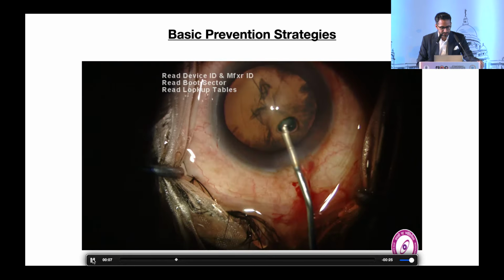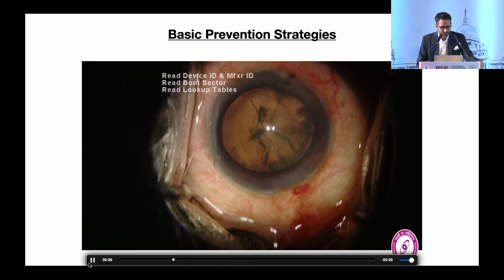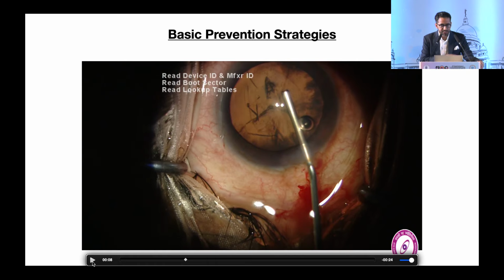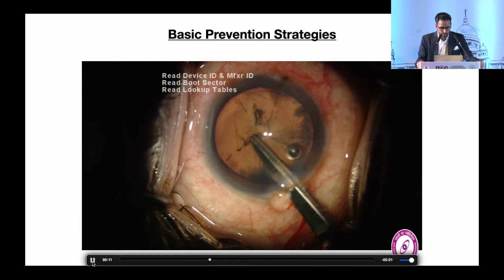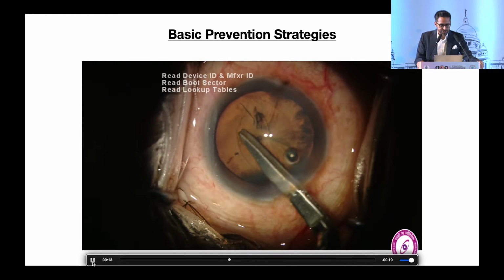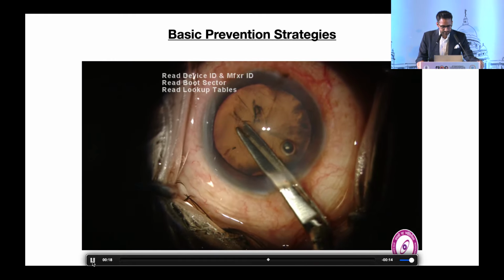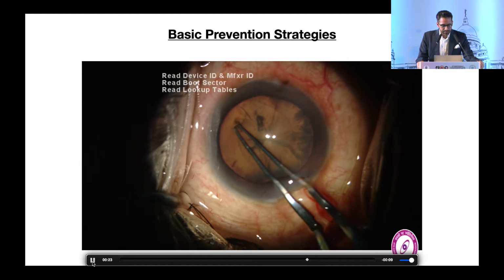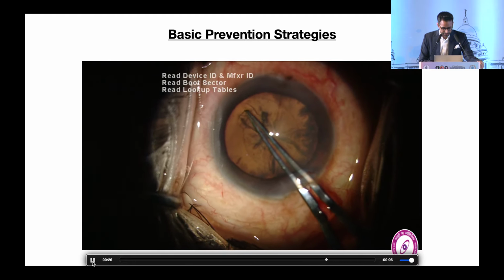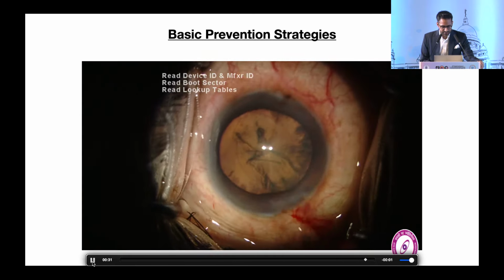What I should have done is inject the viscoelastic on the other side of the flap so that it could lie flat on the nucleus rather than making it go towards the periphery. So how I manage this is, I make a nick on the other side of the capsule and I can complete the rhexis. So this is another way you can manage the rhexis extension.